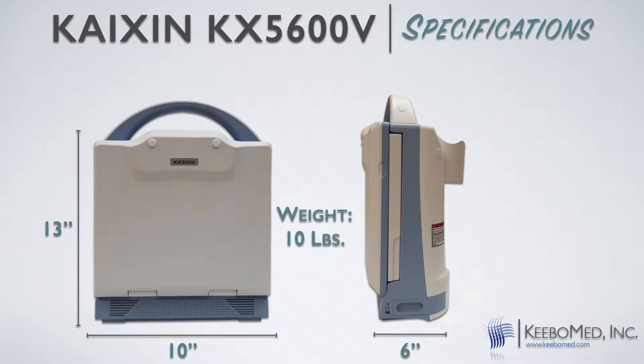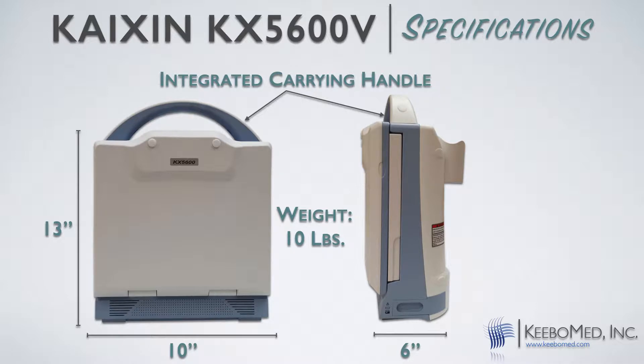Most veterinary ultrasounds are larger and can even be double in weight. In addition, the KX5600 has an integrated carrying handle and includes a lithium battery that will last up to 4 hours. Many ultrasounds include a battery only as an additional option. So really, all these features truly make the KX5600 fully mobile.